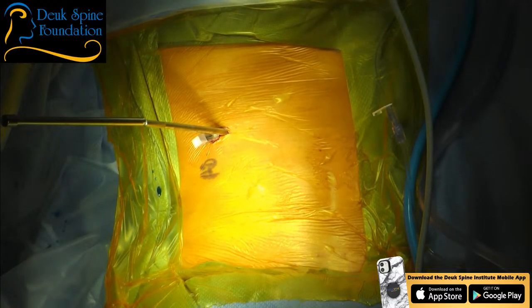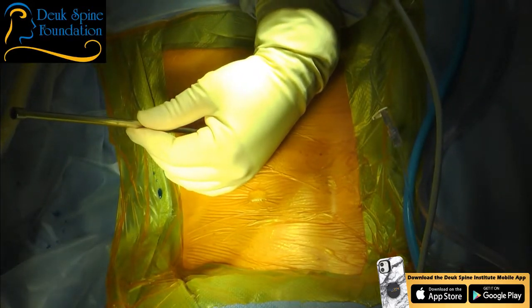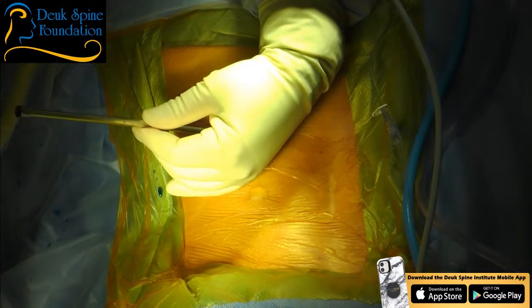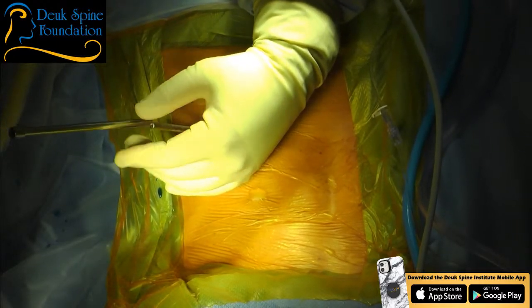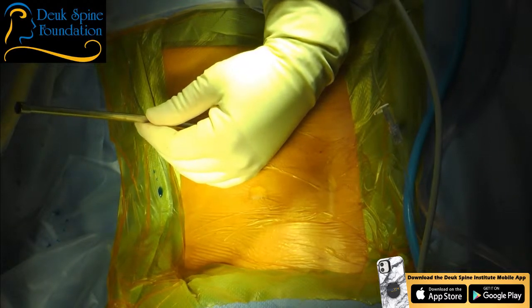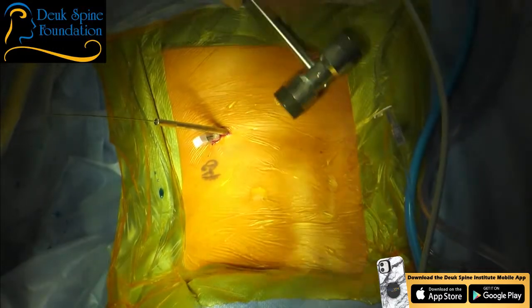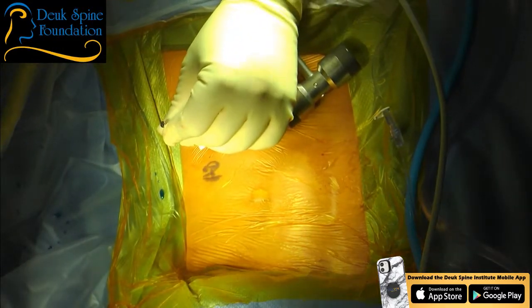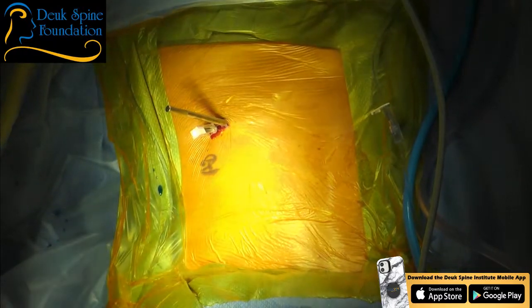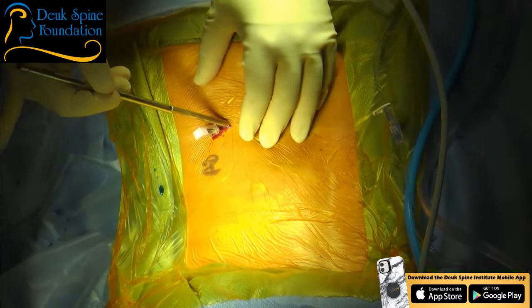Because in MRI you're laying flat on your back. This is a more normal lordotic position of the spine. She's ow-owing, meaning that this is definitely the pain source. We're going through the tear into the disc. Okay. So we're at L4-5. You're going to have to straighten that out. Perfect. I went through the tear. I could feel it go through the tear. And as a result, now we're inside the disc.